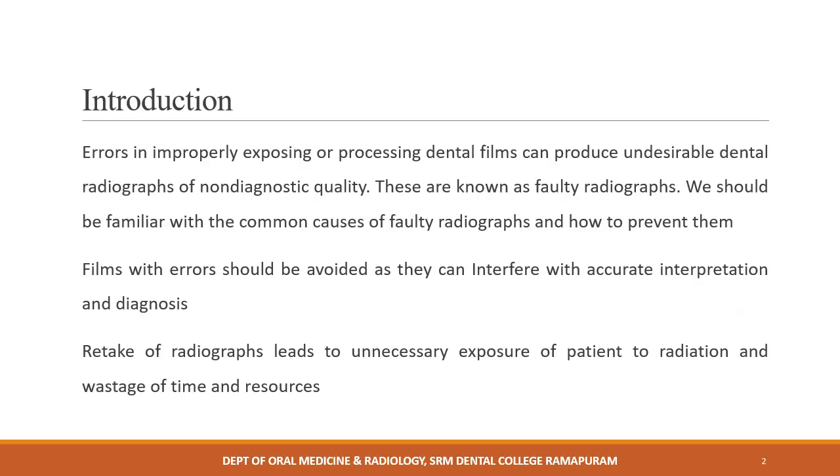Errors in improperly exposing or processing dental film can produce undesirable dental radiographs of non-diagnostic quality. These are known as faulty radiographs. We should be familiar with the common causes of faulty radiographs in order to prevent them, because film with errors can interfere with accurate interpretation and diagnosis. An unnecessary retake of radiographs leads to increased radiation exposure to the patient and wastage of time and resources.